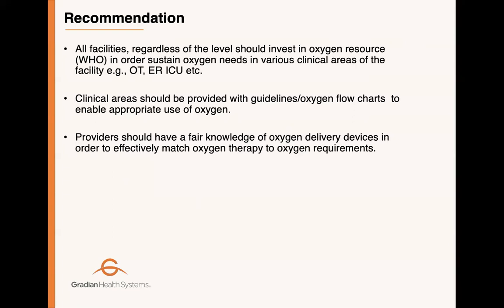So these devices, the prescription and the monitoring, we should step down that training to them. And that really helps you to administer the oxygen properly.